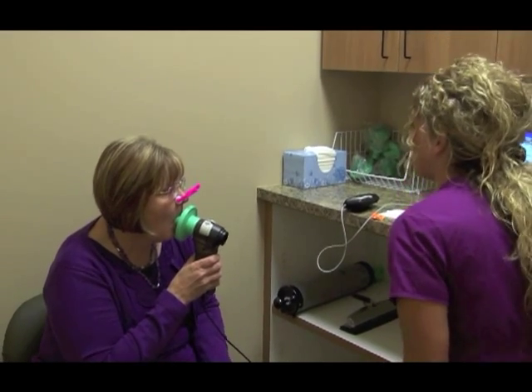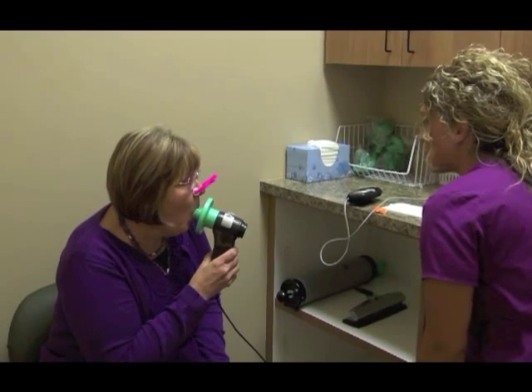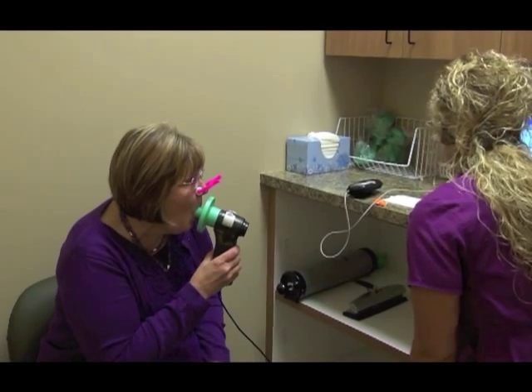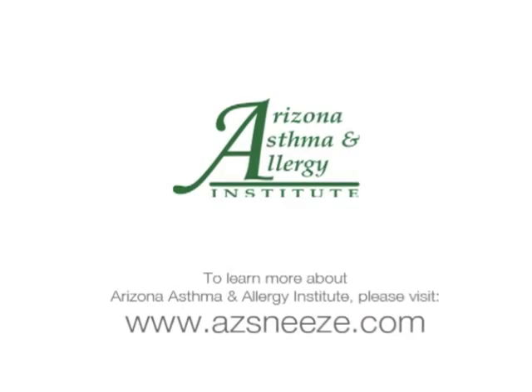Now — big breath in, big, big, big — blast it out hard! Go, go, go, go, go, keep going, go, go. Big breath in. Good job. Good job. Good job. Thank you.